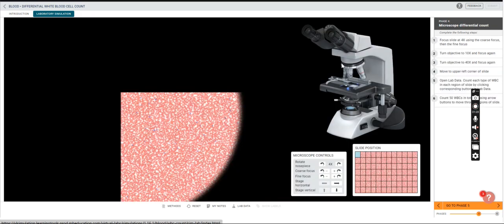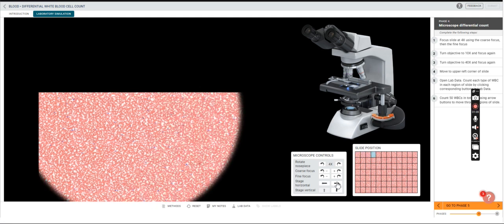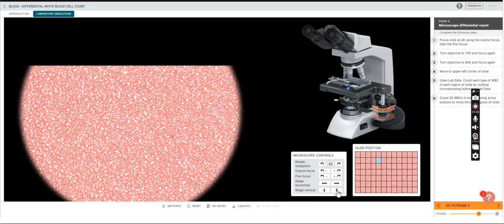And then the part that I wanted to get to is once you've placed your sample on the slide, going through and using this to get some of the images. I'll move it around a little bit so it's not already set up for us. But at first glance, you'll notice we have these tiny little purple, almost purplish, cells. Those are our stained white blood cells.